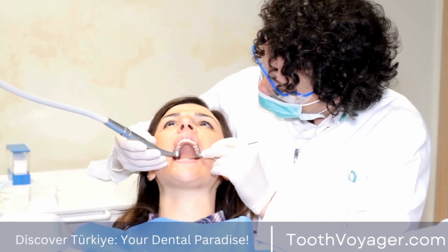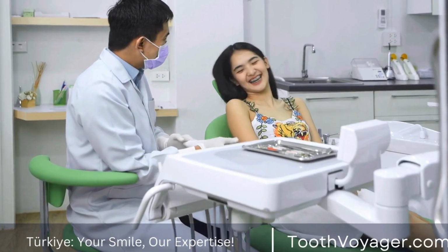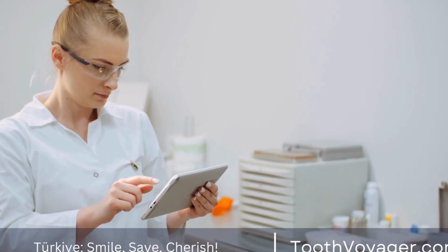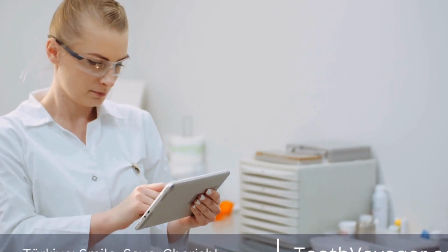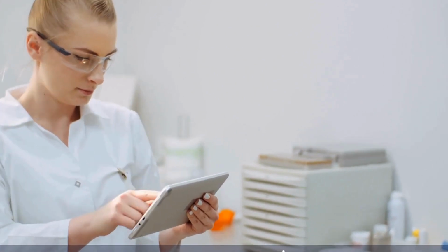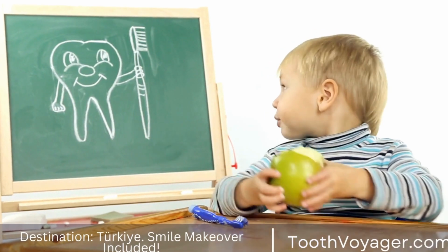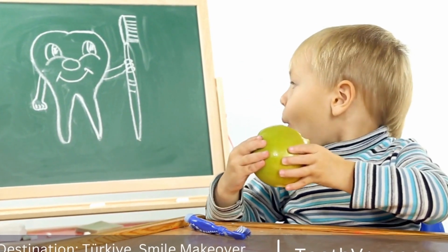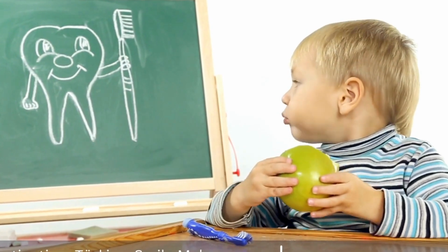2. Mini dental implants. The mini dental implant is less in size than conventional implants and are typically employed in situations when there's not enough bone mass for a conventional implant. Implants can be put in with a relatively simple procedure, which makes them an ideal option for those who wish to stay clear of more extensive procedures.